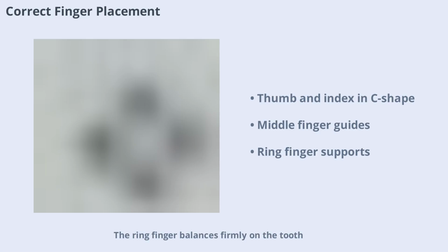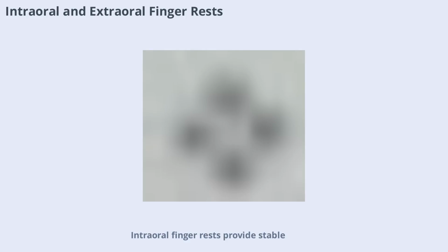The ring finger balances firmly on the tooth, supporting the hand and instrument. The little finger is relaxed and has no function. Intraoral finger rests provide stable support for the clinician's hand, allowing precise control with minimal movement.